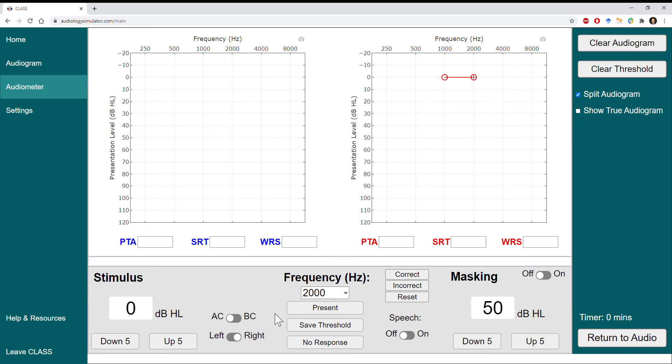Note that the program requires testing at 3000 and 6000 Hz unless you change these settings in the Settings tab, so I'll go ahead and complete testing at 3000 Hz to create a complete audiogram. I've confirmed testing at 3K three times at 5 dB HL, so I'll save that threshold using the Enter key and move on to the next thresholds.